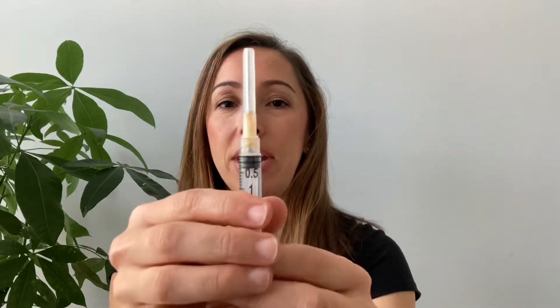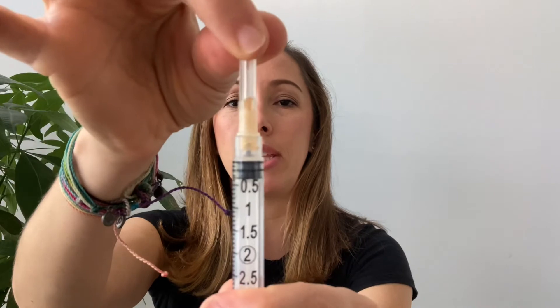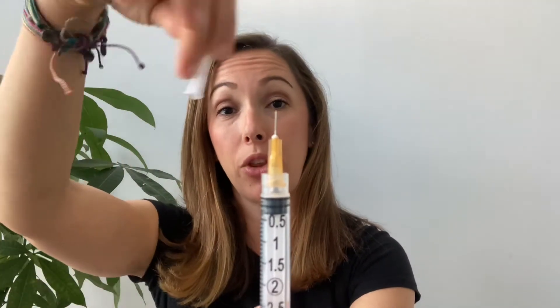The next step is to remove the needle cap — pull it straight up, don't twist it otherwise you'll take the needle out. Now grab your insulin. I'm using normal saline for demonstration purposes, but you want to make sure the only insulin you put in your pump is either Novolog or Humalog. Only rapid-acting insulin goes into your pump.